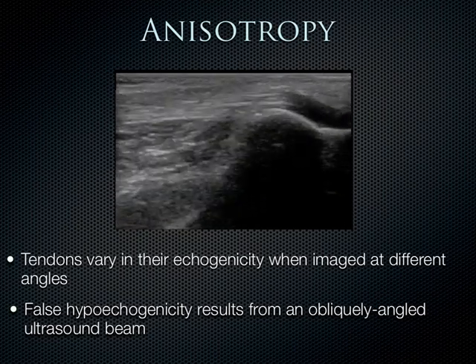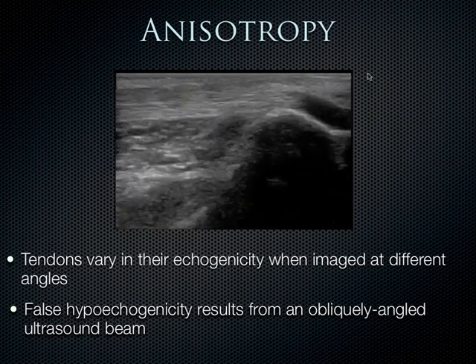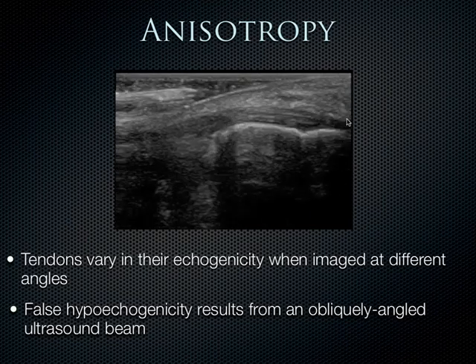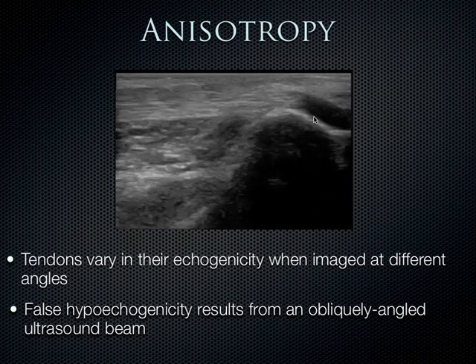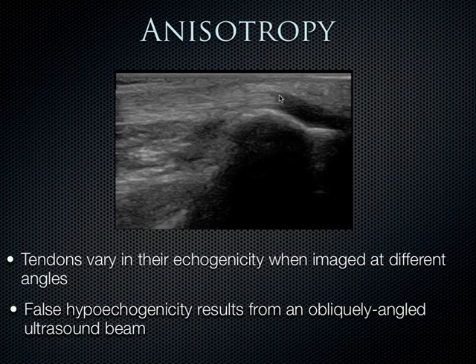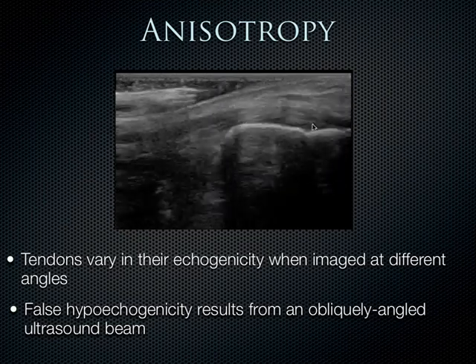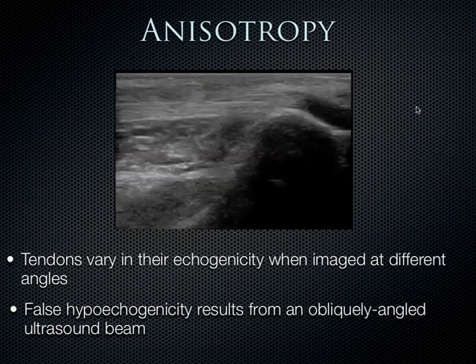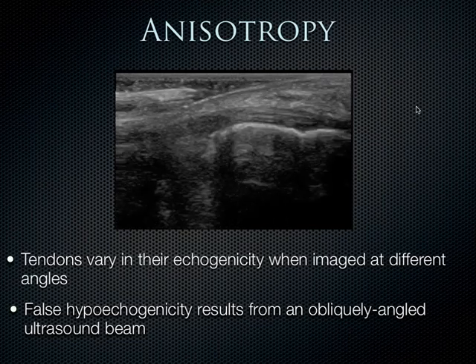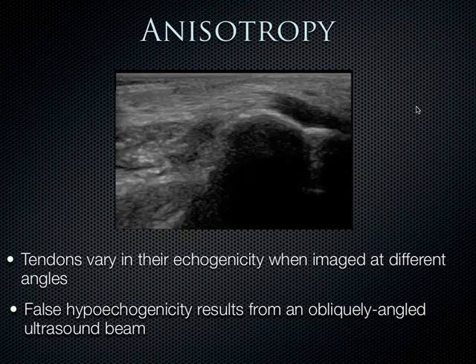Now, as this video illustrates, this arrow points to the tendon as it's coming along here, and then suddenly there's a drop off right there. Does that mean there's been a tendon rupture, or is this just false hypoechogenicity from an obliquely angled ultrasound beam? And that's exactly what happened here. As the tendon was trying to come across this bone here, the ultrasound hit it at a different angle. Once we correct the angle, we can see the rest of that tendon again. So just be careful with that concept of anisotropy: false hypoechogenicity from an obliquely angled ultrasound beam. You see it with tendons mostly.